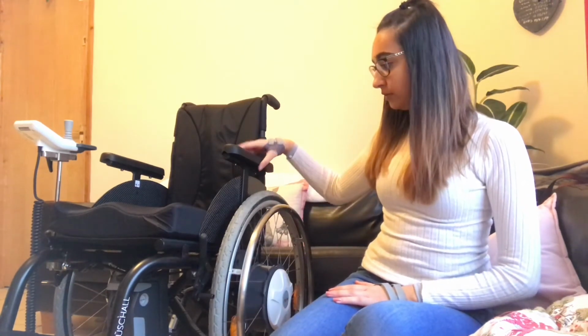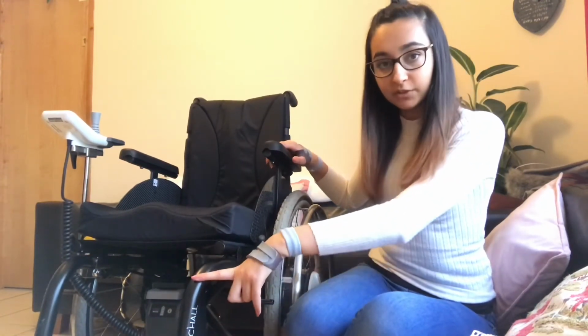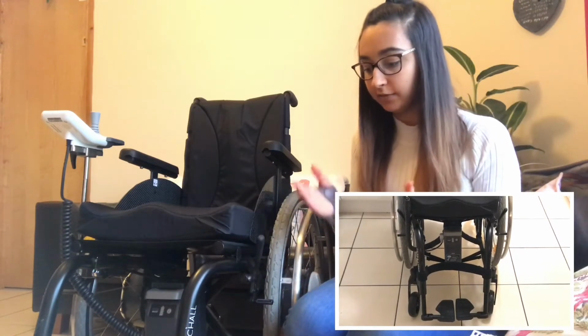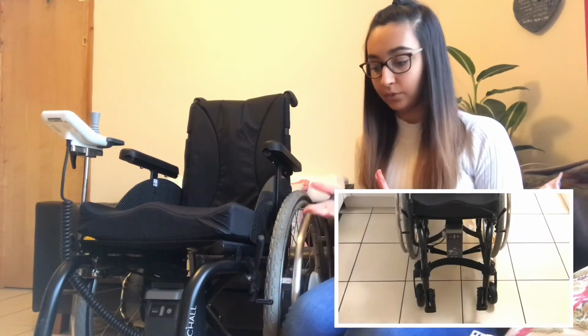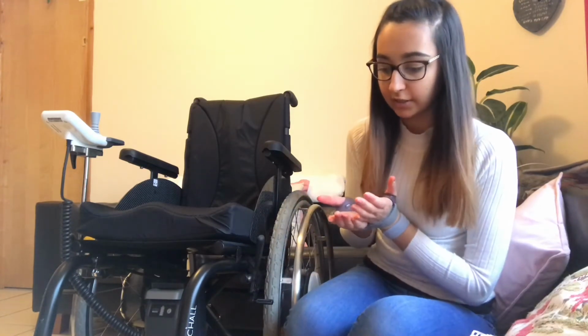One thing is that I did get the armrests again, which are just a must for me. If you're really dizzy or have fatigue, then they're just really helpful. And these ones are removable and they're the shorter length, but just having them is really handy. I've got the same mud guards, and then I'm going to insert a clip of the bottom of the chair, but it's got a V-shape tapered frame, and then I've actually got carbon foot plates, and I'll show you those as well. They actually swing up on my chair, so it looks like one foot plate, but actually they flip up as well.